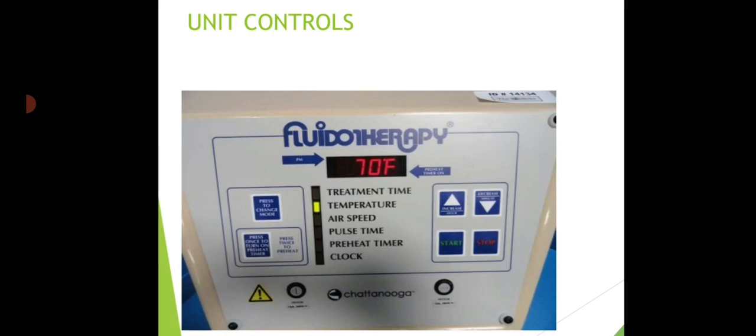Unit control, this is how it looks. Here you can see the temperature settings, the pulse time, the preheat timer, the clock and everything. According to the area being treated, the capacity of the person, and the condition you are treating, you can set the temperature. And this unit has a specialty that it can be preheated before starting the therapy.